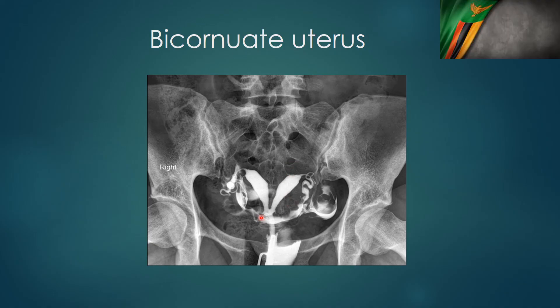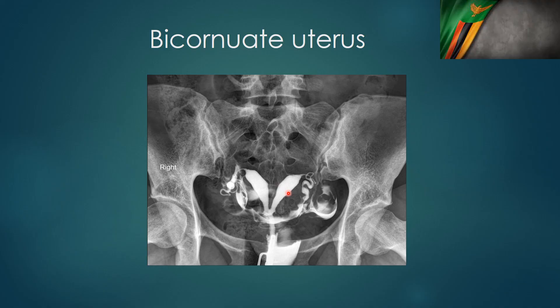Lastly, this slide shows how HSG can be important in identifying uterine abnormalities. This is a bicornuate uterus. Remember that the Müllerian system on the left and right sides normally come together to form a uterus. When that fusion is not complete, we can see one horn on the right side and one horn on the left side of the patient. The tubes appear open apart, and we can see spill on both sides. So an HSG can reveal significant uterine abnormalities.